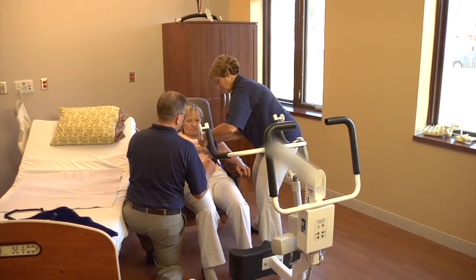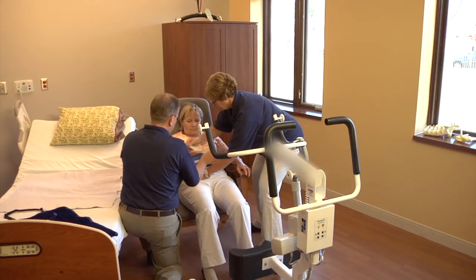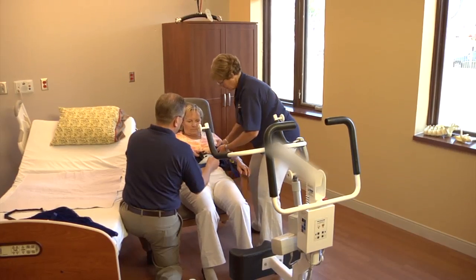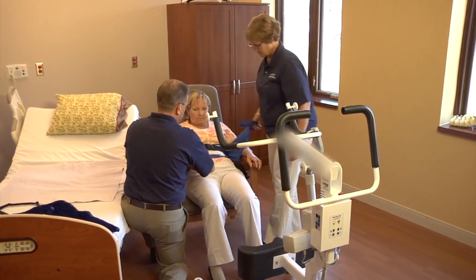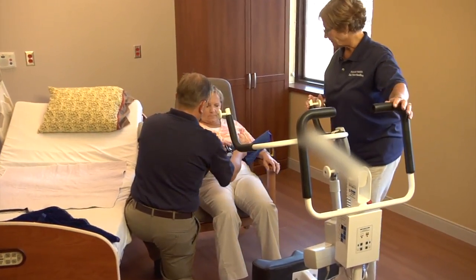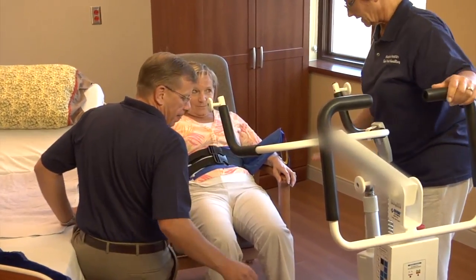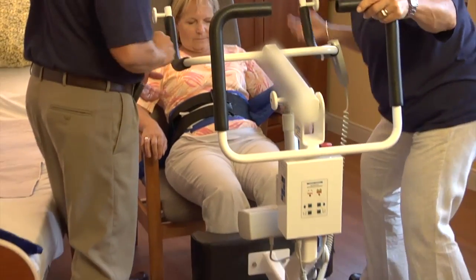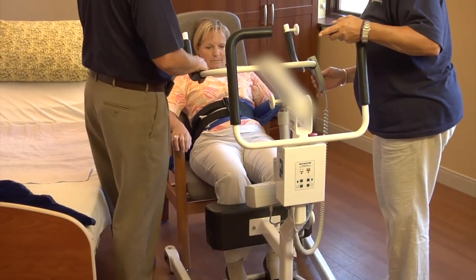So in this example, we're going to show you how a sit-stand lift can be used to lift a patient just enough to reposition them. Of course, if the patient does not fit the criteria at all and you're afraid to use a sit-stand lift, you're going to want to put a sling under that patient and use a full mechanical lift. But many times you can reposition with a sit-stand lift and get a pillow or a new cushion under a patient that'll stop them from sliding.